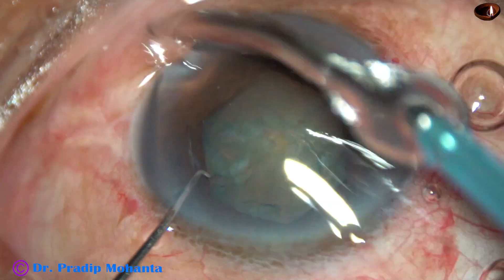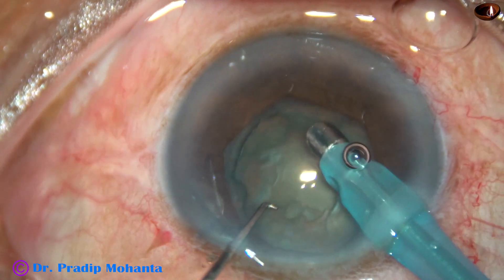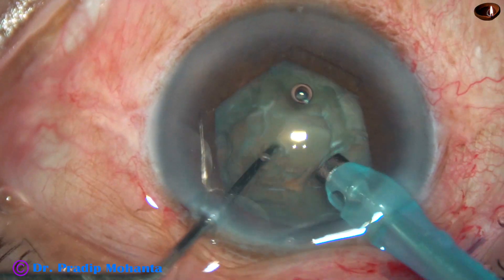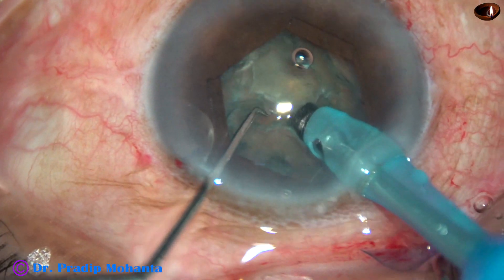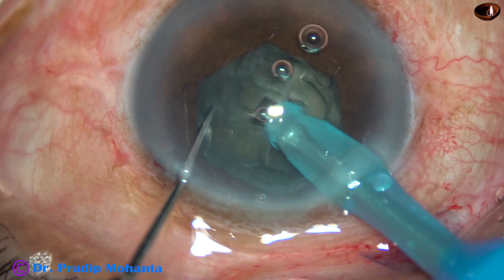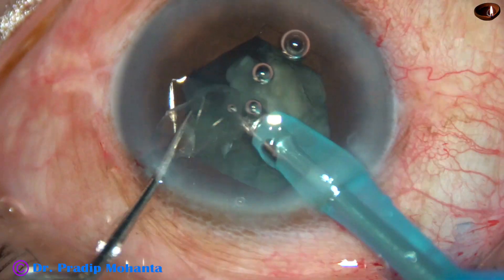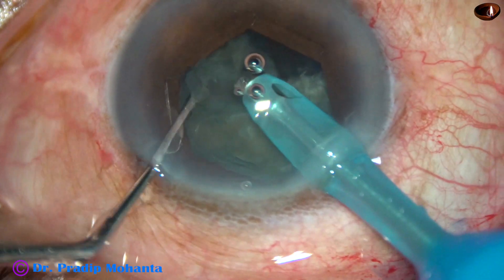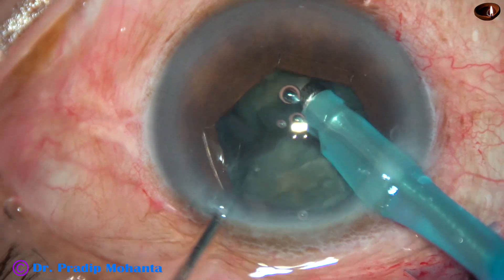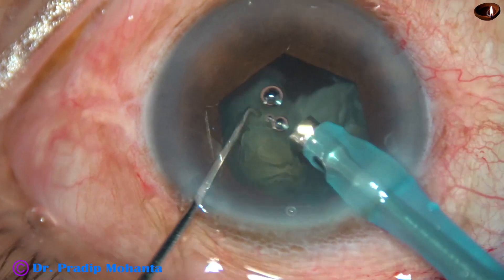This is a totally unedited surgery. The phaco needle goes bevel down. Some superficial cortical lens matter is removed. Now the handpiece is turned — bevel is up. The tip is buried into the nuclear mass and then the nucleus is chopped into two halves. The chopper being used is known as the Mohanta chopper — it's a small chopper, made by Dosa Surgical as well as PLAS Surgicals. Phaco power used is 60%, flow rate is 45 ml per minute, and vacuum is 450 mmHg.